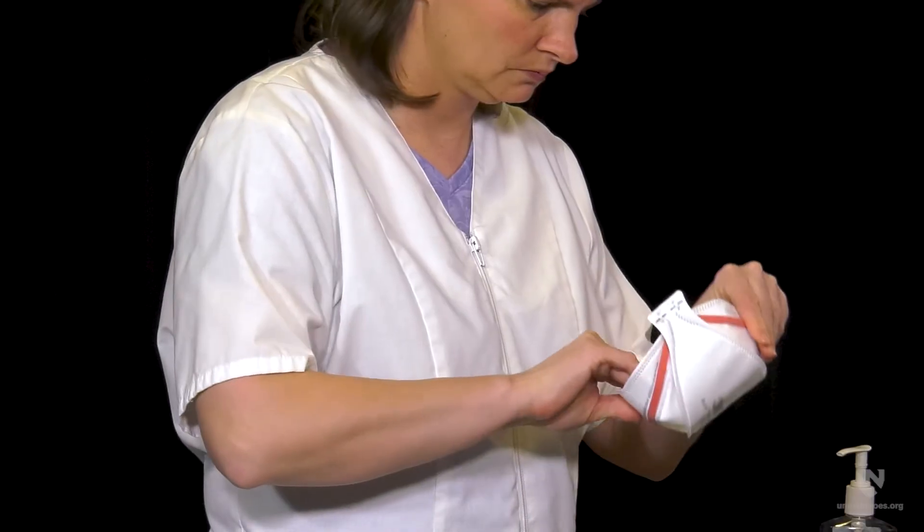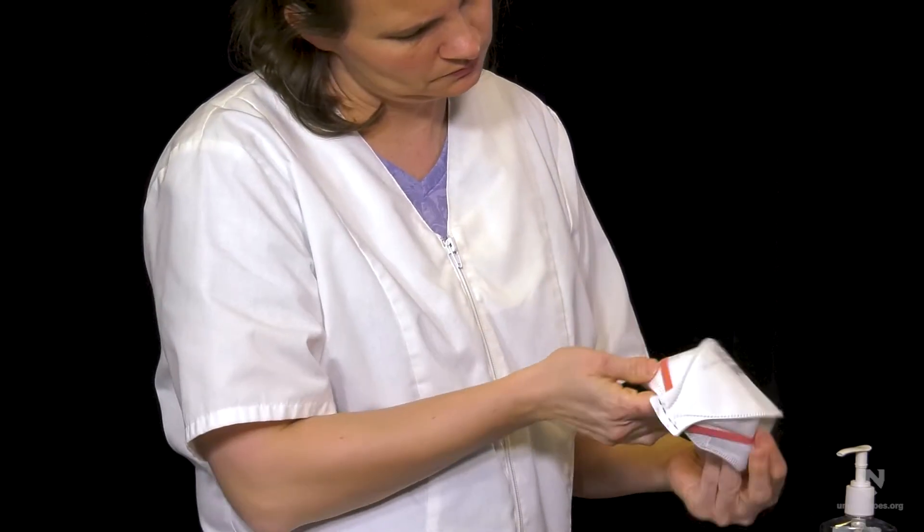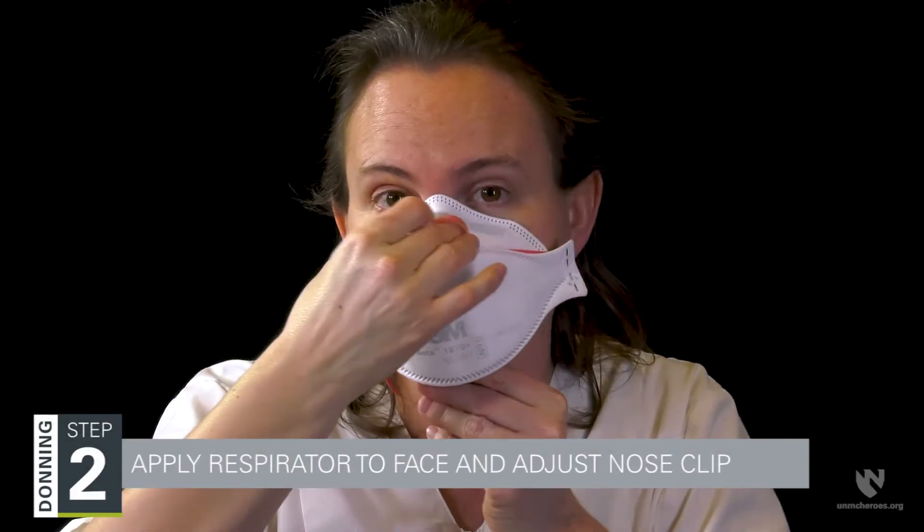Prior to donning, you should examine your respirator for manufacturing defects. The second step is to apply the respirator to your face and adjust the nose clip.